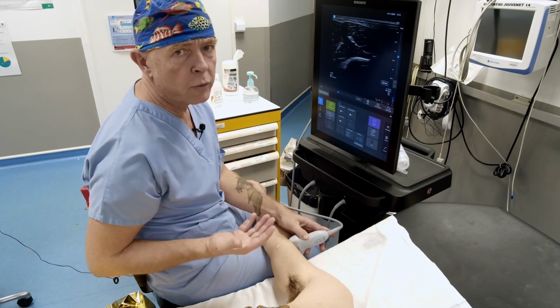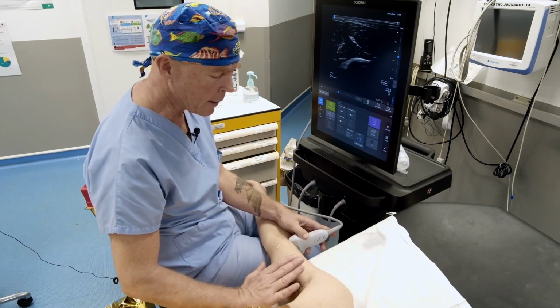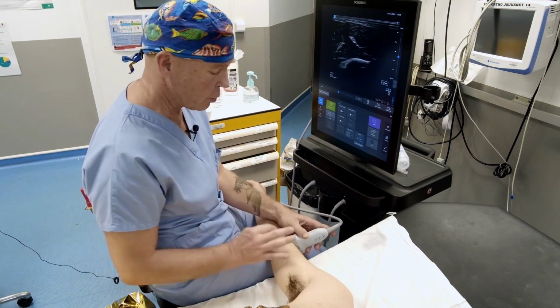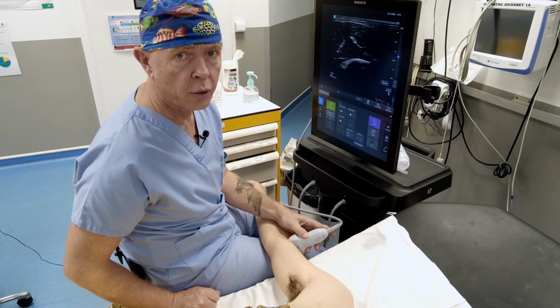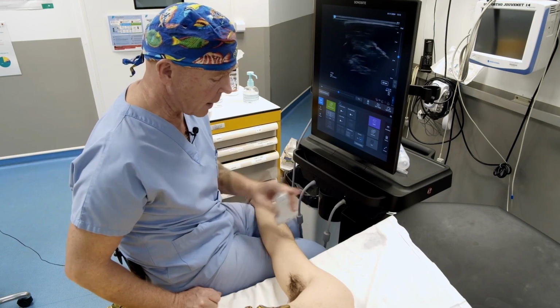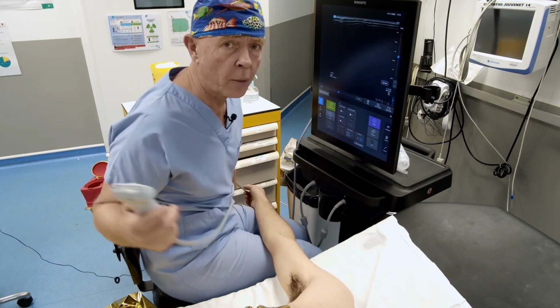Basically, when you start your axillary blocks, it's not very easy. You perform your block at the axillary level, and then if there's one of the structures you didn't see clearly, you keep the position and inject 3 to 4 cc for the additional injection at the elbow. We'll take this opportunity to show you the last one, and all of this will really help you achieve 100% success at the beginning.